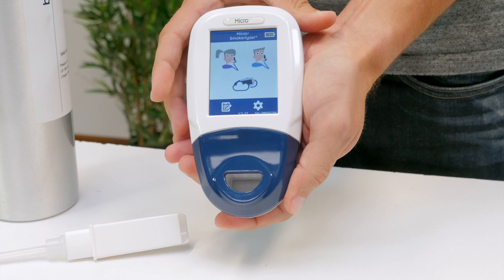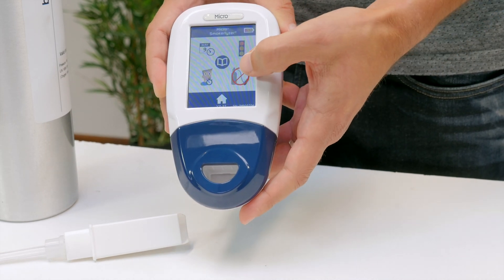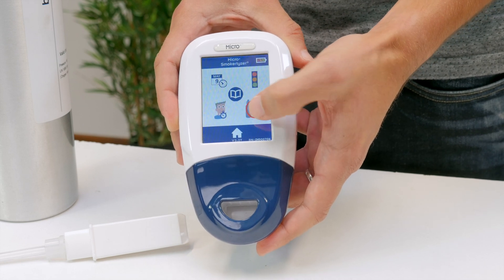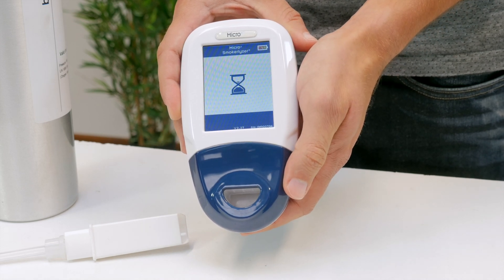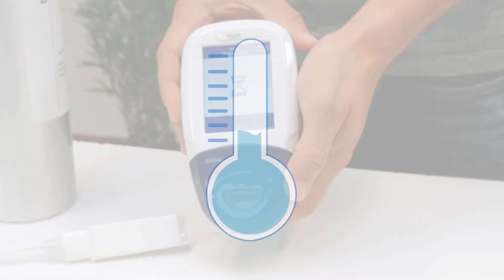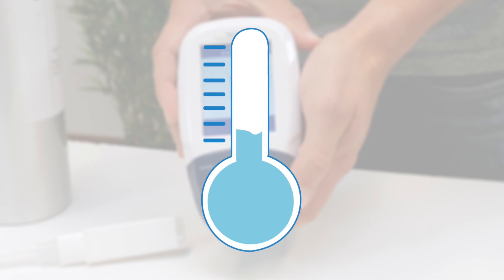Turn on the monitor by pressing the power button once. Press the settings icon, followed by the calibration icon five times to unlock calibration, then the calibration icon once to proceed. If the temperature of the monitor is too low to calibrate, the blue thermometer will be shown — try again later once the unit has warmed up.